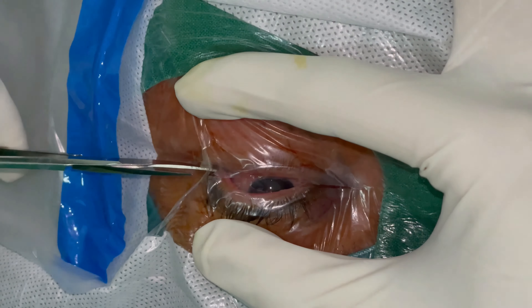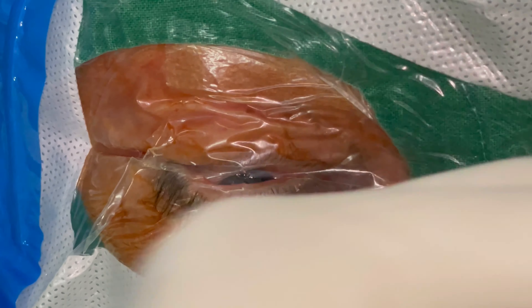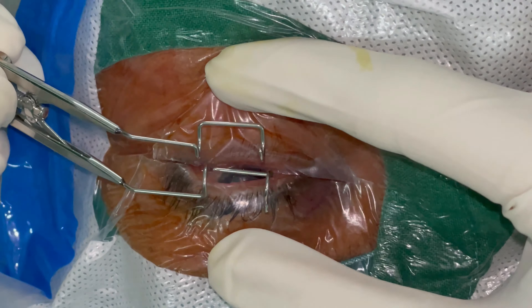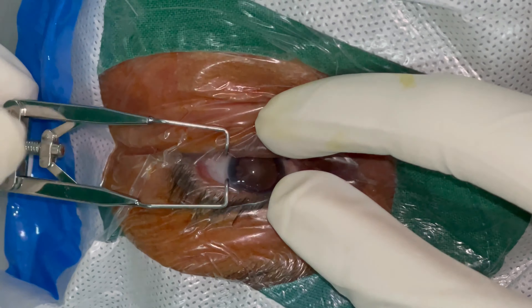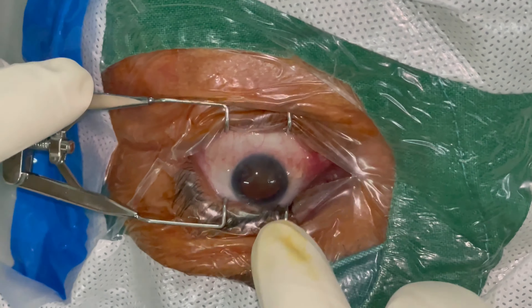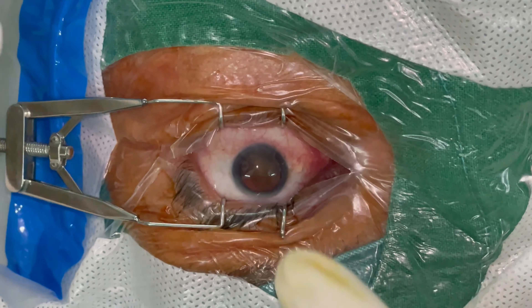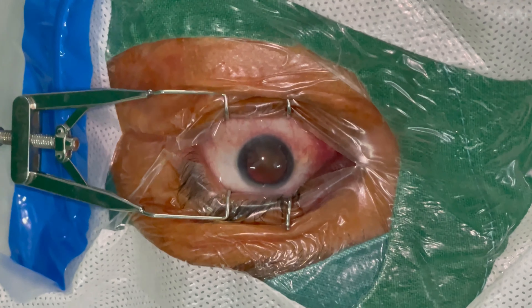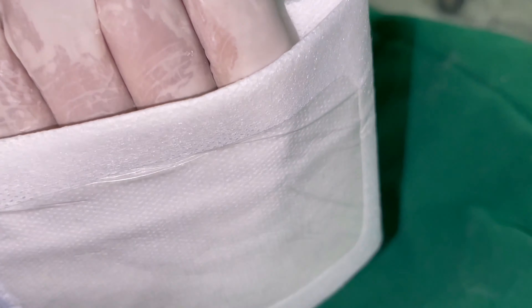Having cut the drape down its middle in the exposed part of the eye, the next and final step is placement of the speculum — first the upper and then the lower, though the choice is yours. The speculum is then opened just enough to allow for adequate exposure to carry out the surgery comfortably.